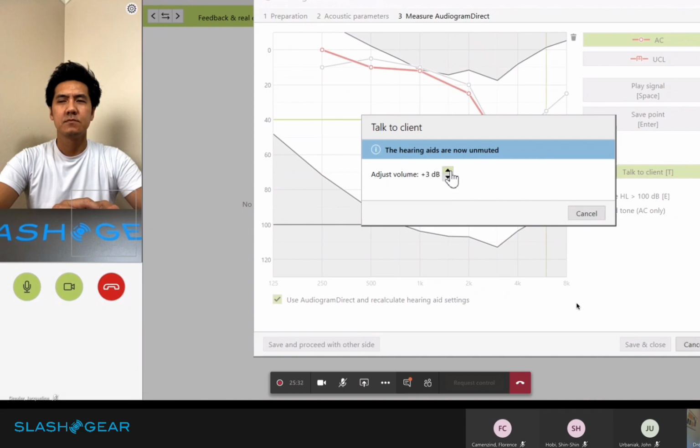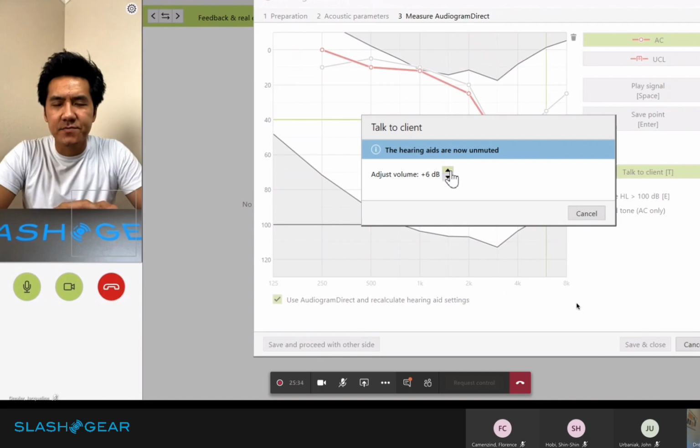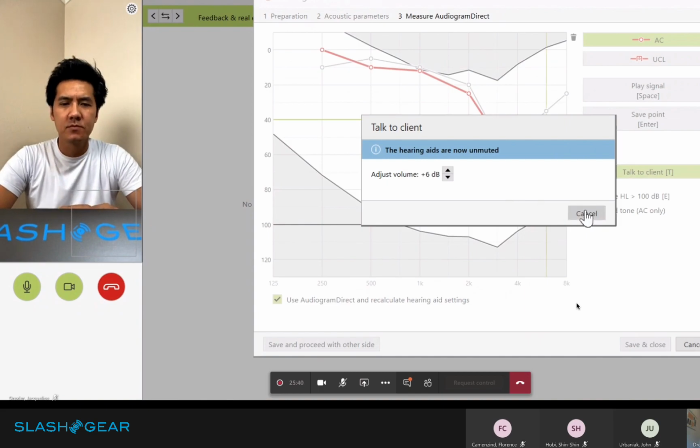Can you hear me okay, Vincent? I can, yes. Okay. So I just finished the right side. I'm going to now switch over to the left. Okay? Okay.